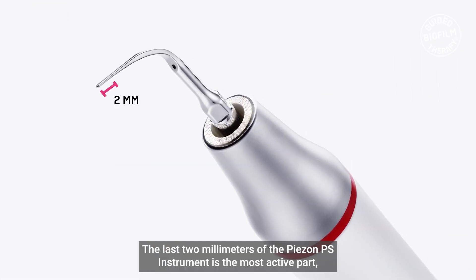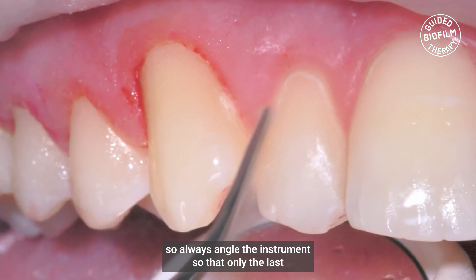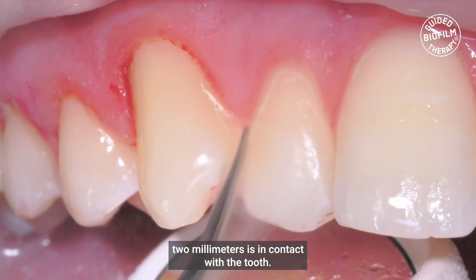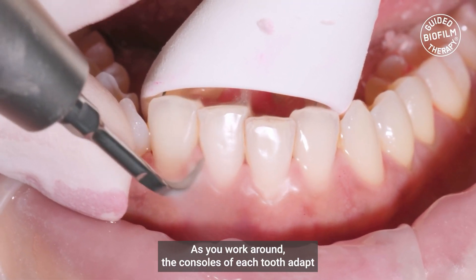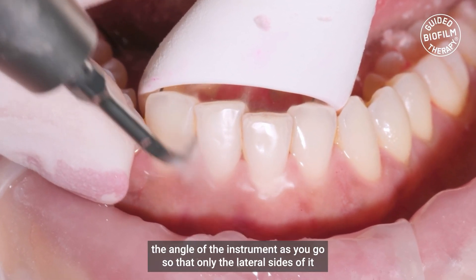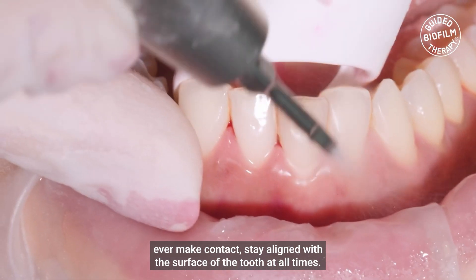The last two millimetres of the Piazon PS instrument is the most active part, so always angle the instrument so that only the last two millimetres is in contact with the tooth. As you work around the contours of each tooth, adapt the angle of the instrument as you go, so that only the lateral sides of it ever make contact.